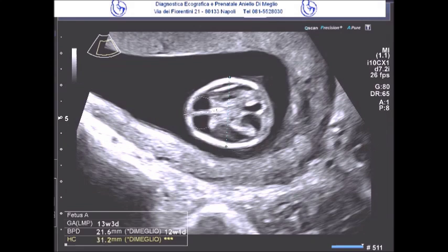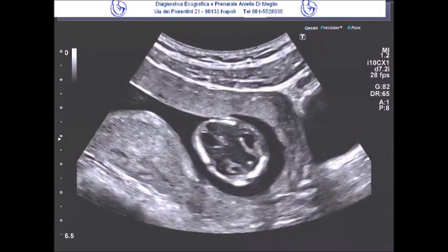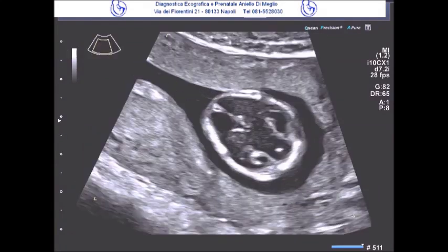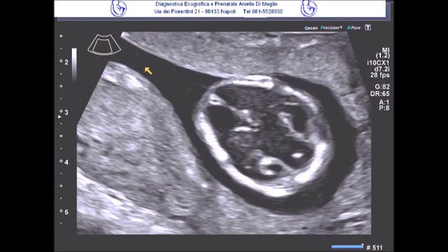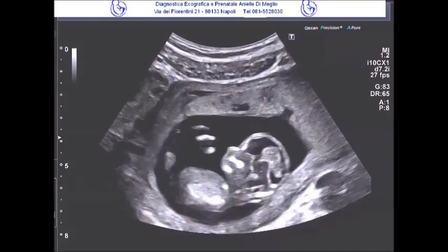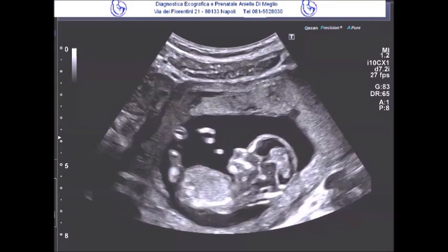To start our analysis, let's begin the examination from the cephalic end, where in the axial scan we can identify and observe the presence of the so-called crash sign. That is, the caudal displacement of the midbrain, which impacts, hence the term crash, against the clivus surface of the occipital bone. This process occurs primarily due to the continuous loss of cerebrospinal fluid at the level of the spinal defect, which drags both the cerebellum and the brainstem downward.